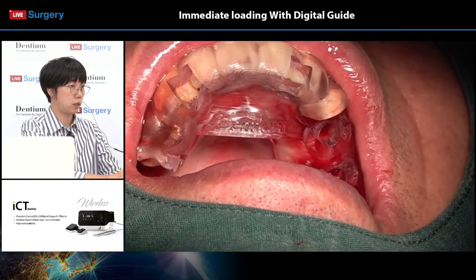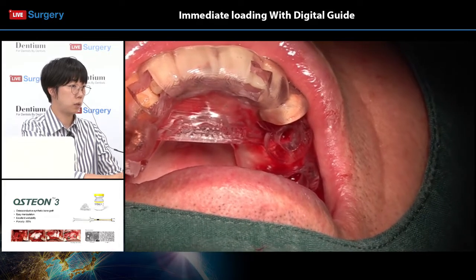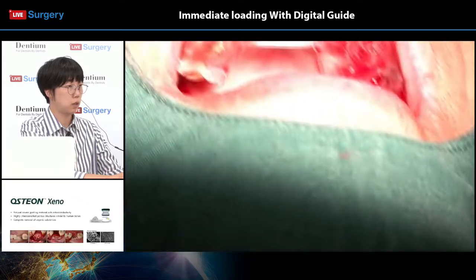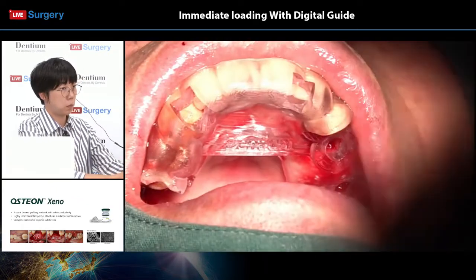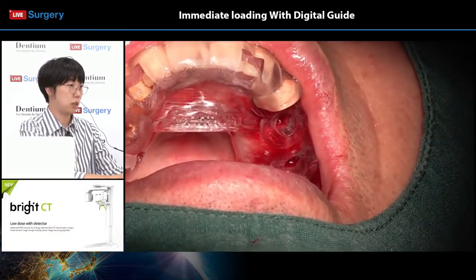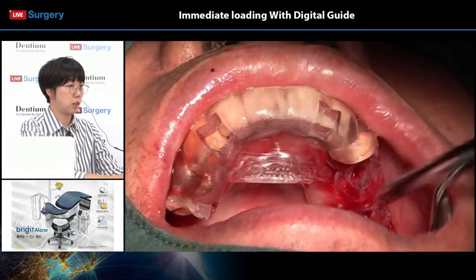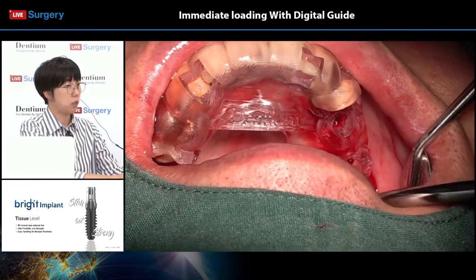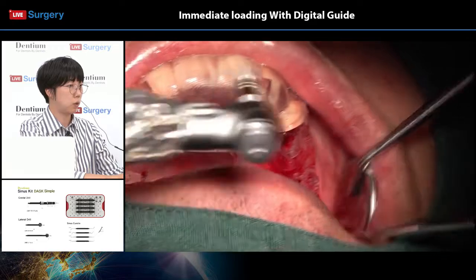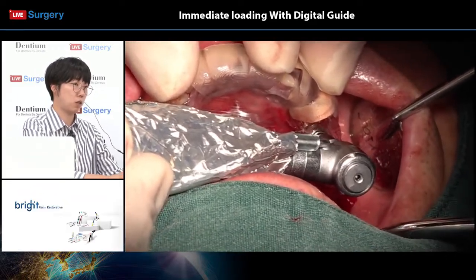Apart from underdrilling the diameter, another way to ensure initial stability in the maxilla area is to perform osteocompaction. Osteocompaction can be done using the osteotome, as we know, or using a specially designed burr, which is available in the market today. But usually, dentists mostly use the osteotome, but it depends on the surgeon's preference.